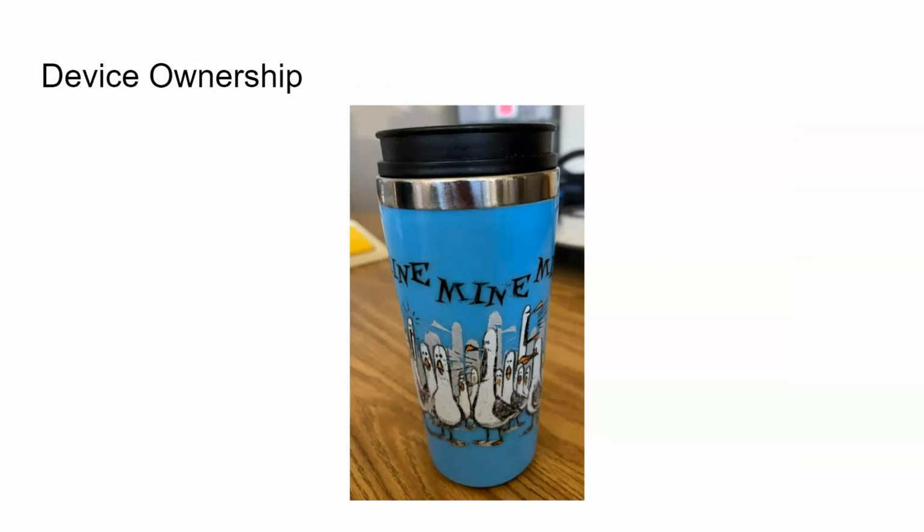As I said back at the beginning, districts are required to make sure that your student has the system they need to participate in the academic environment. Once a student becomes good or proficient with using a device, I recommend that families consider purchasing their own device. Insurance policies, Medicaid, and even grants can cover communication devices. This is more to ensure that the device is yours, regardless of any changes in residency or in your school system. It's ultimately a family's choice.